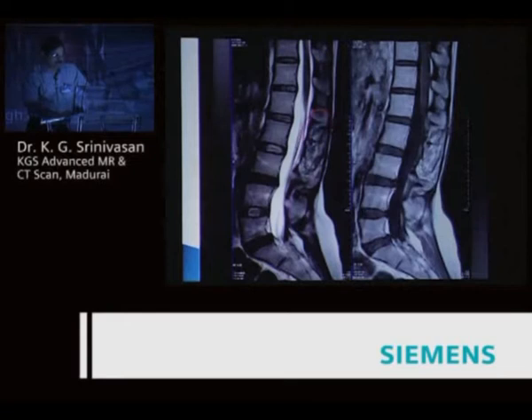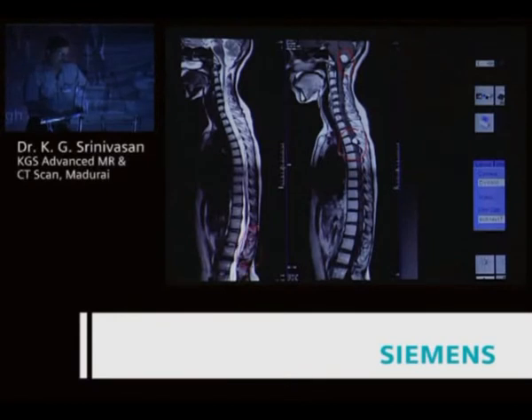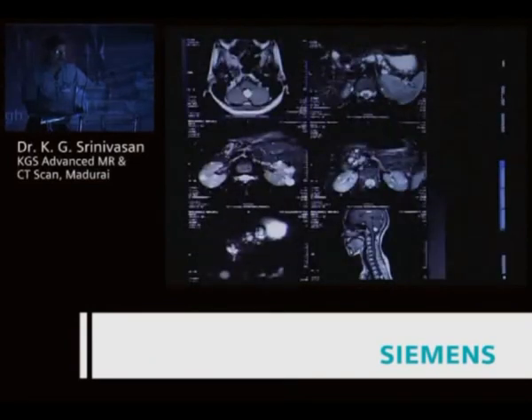You can see a large area of laminectomy defect but symptoms are not improving. On further evaluation you can see a large brilliantly enhancing lesion with secondary cysts, and one more lesion in the cerebellum. It is a case of hemangioblastoma of the spinal cord and hemangioblastoma of the cerebellum. The patient had a neurofibroma operated but the team missed all these lesions — you should think of von Hippel-Lindau disease and evaluate the rest of the areas.